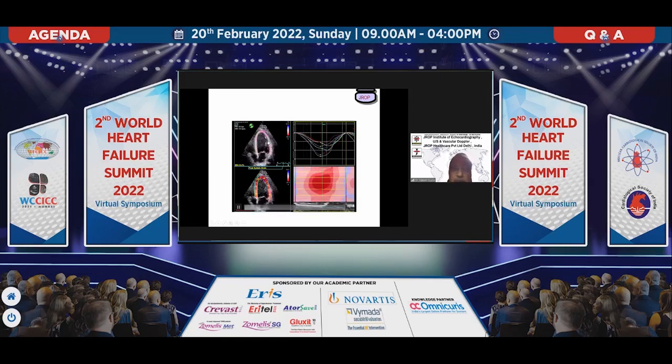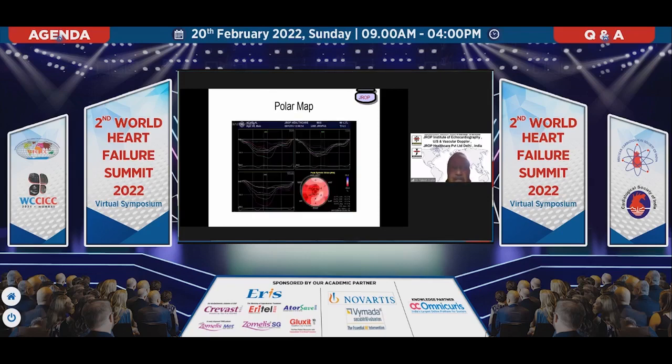Similarly, we look at the 4-chamber view, which every one of us devotes time to. It tells you a normal LV systolic function. Look at what exactly happened. Post-systolic thickening is still happening, despite some sections having shown almost complete contraction, while the other segments are showing a post-systolic contraction. And once we look at a 2-chamber view, the same thing is present. It's not only that the LV function is down, but at the same time it is telling you, look, these are the segments which are showing dyssynchrony, not a synchronized contraction.